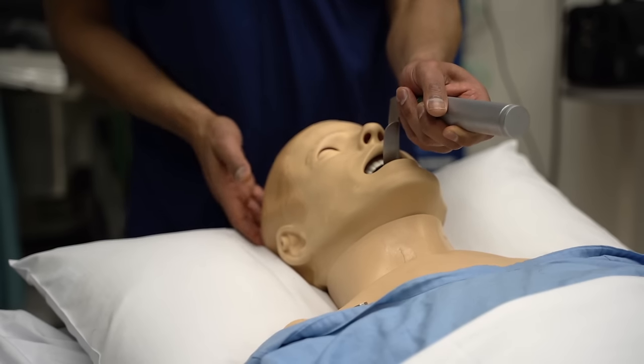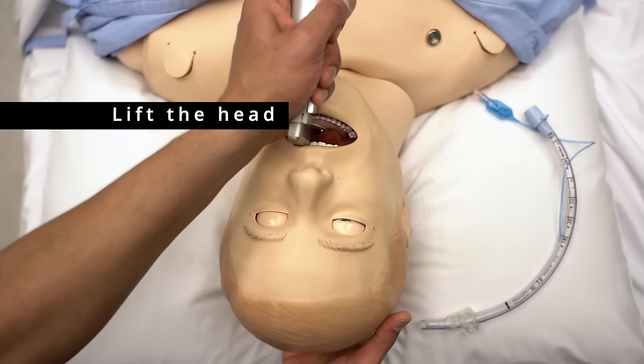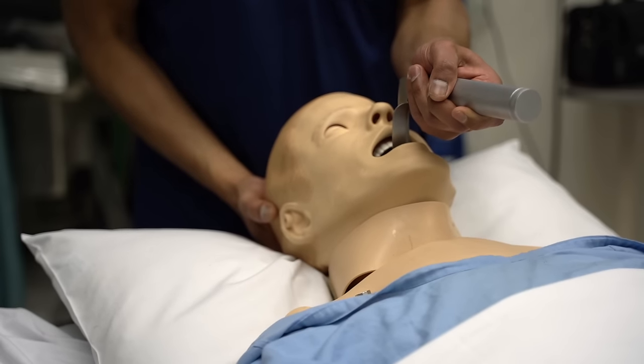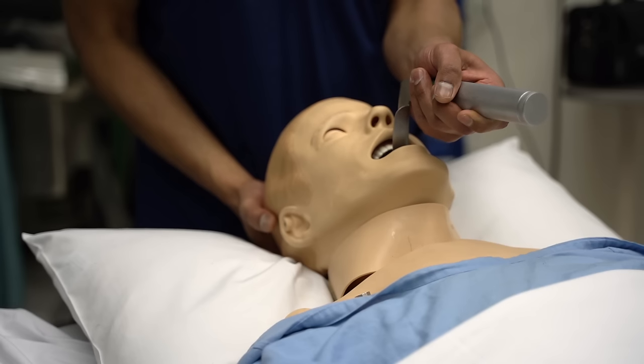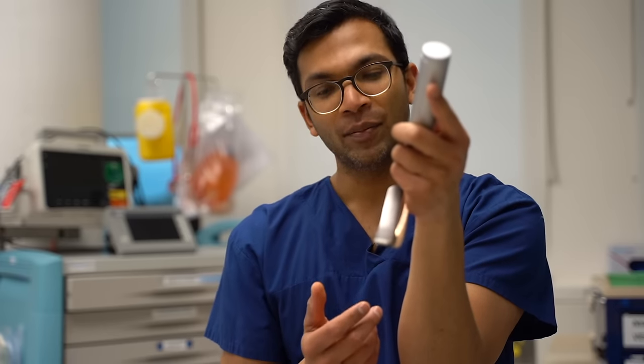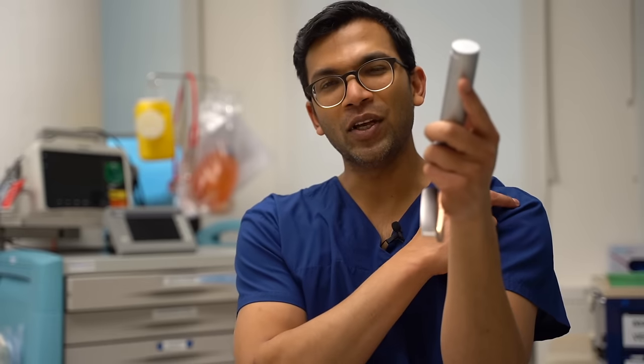Sometimes you still don't get a view, and the very next step is to lift up the head, though that can be quite difficult. I can get a really good view by just lifting the head — it opens up everything a lot better — but holding that can be really difficult, so I get my assistant to help hold the head in the right position. Finally, if you just don't have enough force, bring your arm to the center and rest it on your chest. Pushing forward slightly improves the force you can apply because you're not just lifting with your deltoid, which is a pretty weak muscle — you're moving your body forward to help lift.